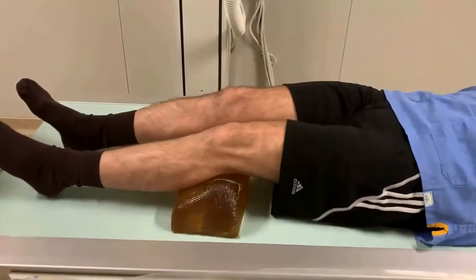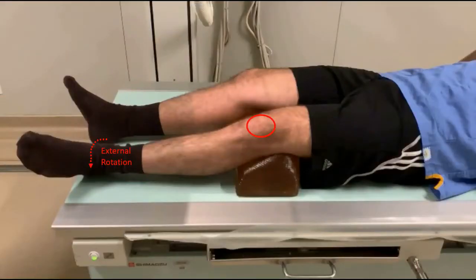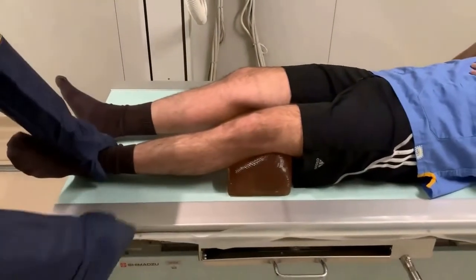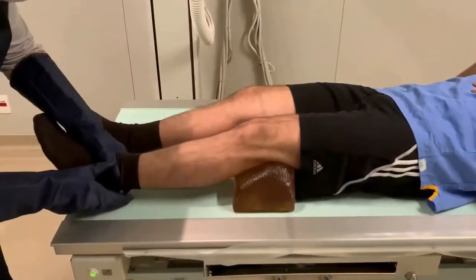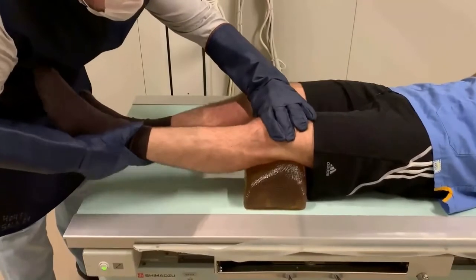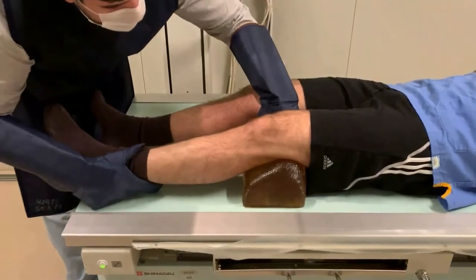We must pay special attention to the rotation of the lower limb, correcting such rotation as in the case in question, which presented with increased external rotation. We identify the articular interline, positioning one hand on the distal end of the femur and the other on the distal end of the leg, again observing the rotation and keeping the patella at the zenith.